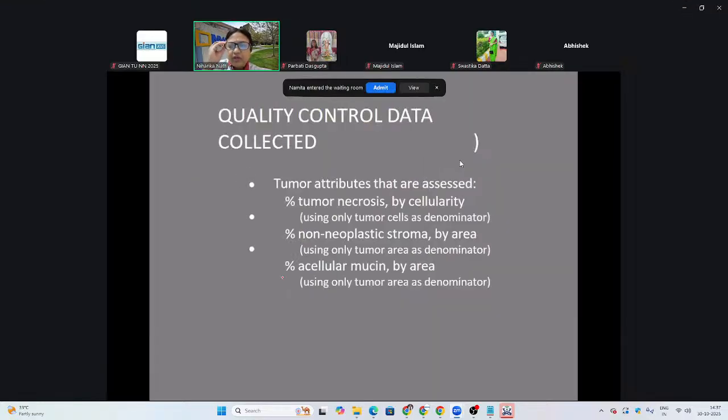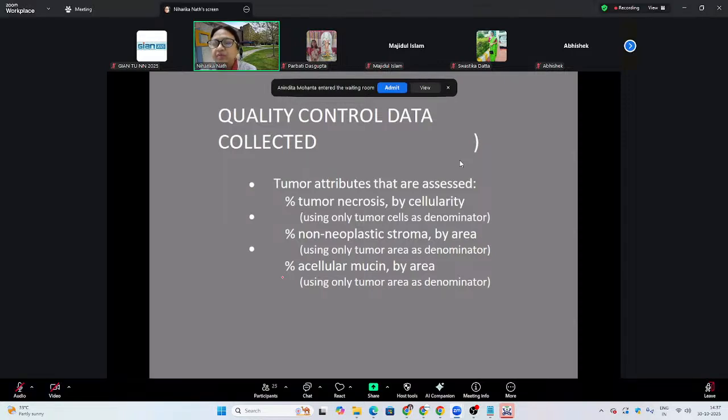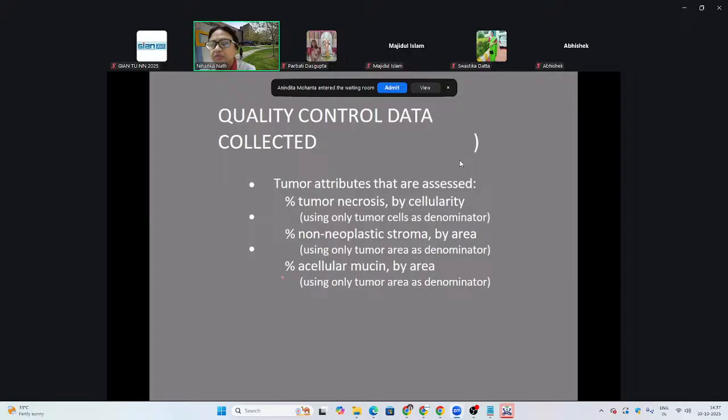And so when these are stained, we are not going to go through the exact process of staining because we looked at it the other day. But when we look at slides, everything has to be controlled. Everything has to be compared with a control. There has to be some kind of normalization. There has to be counting at different places.